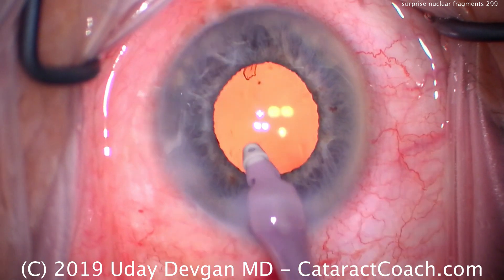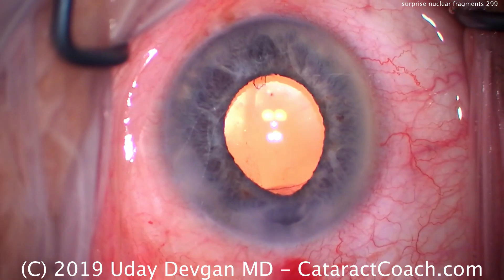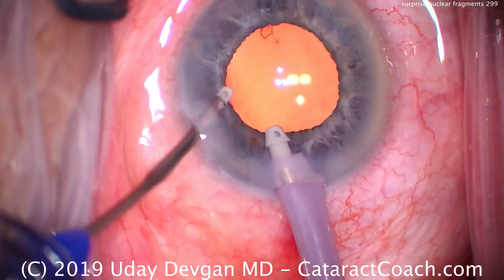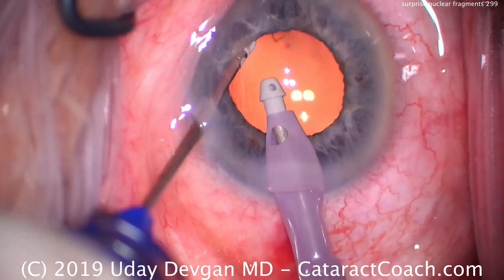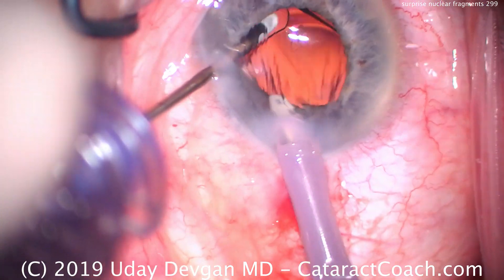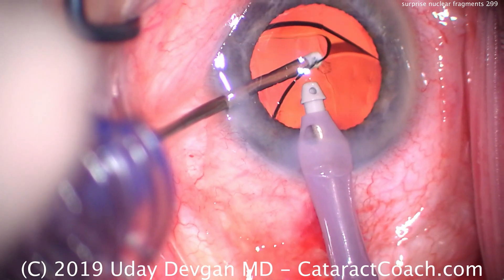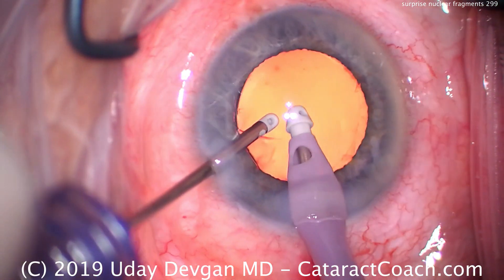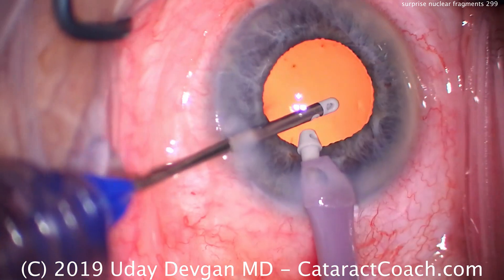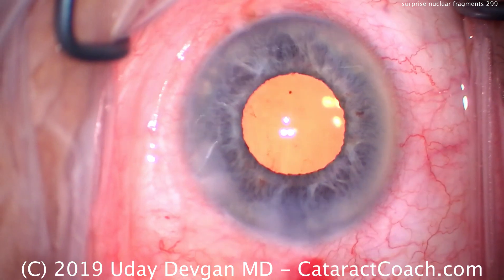So at this point I say, okay, we've got to split this handpiece — we're going to do this bimanual approach. Because the suction now in the left hand is much smaller, we can maneuver it underneath the IOL optic a lot easier, and we keep the infusion in the front of the eye. Go a little bit more — there it is, and we got it. Beautiful. Now make sure the IOL will stay in the capsular bag and that all these maneuvers didn't cause it to prolapse partially out of the bag. And that looks great.